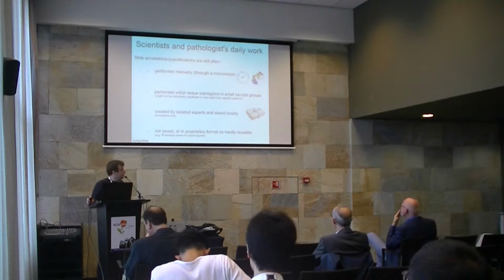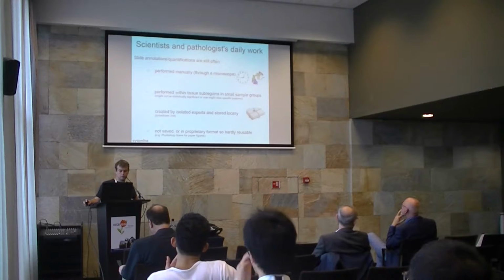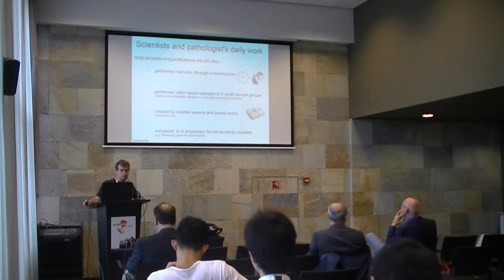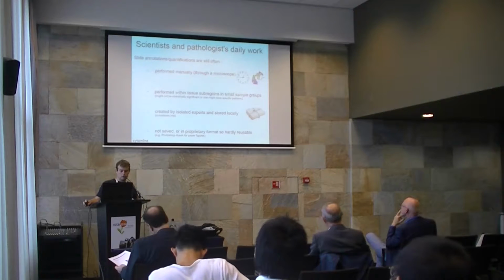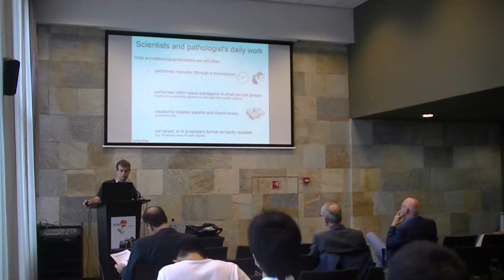Also, we realized that they are often working in an isolated environment, so they store images and their results locally, sometimes on their hard drives. And often these results and images are somehow lost because of this local storage.